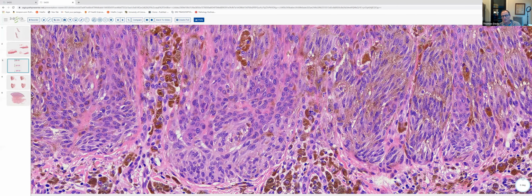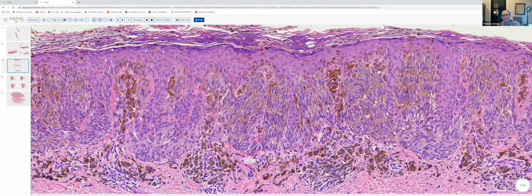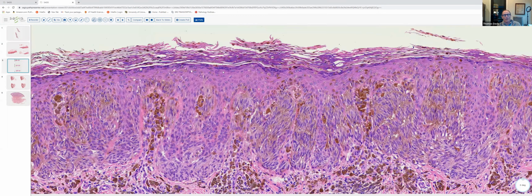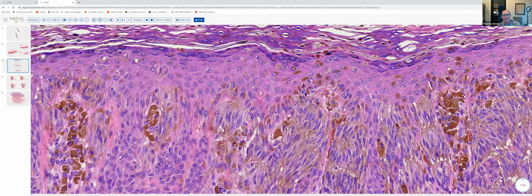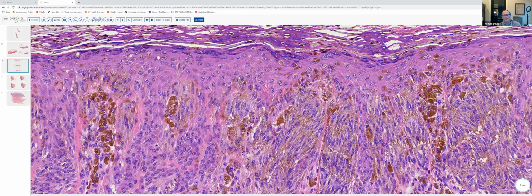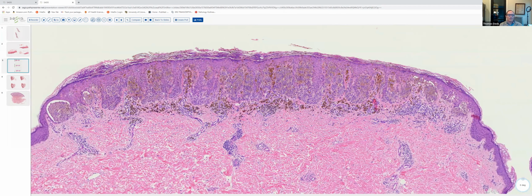This is a largely junctional pigmented spindle cell nevus. There are a few nests of melanocytes down in the papillary dermis. In the central portion of the specimen, there is some upward scatter of melanocytes into the overlying spinous, granular, and cornified layers. But the lesion is architecturally and cytologically very bland, and this pagetoid scatter is present in the central portion of the specimen. And so this has all of the classic features of a pigmented spindle cell nevus of Reed.